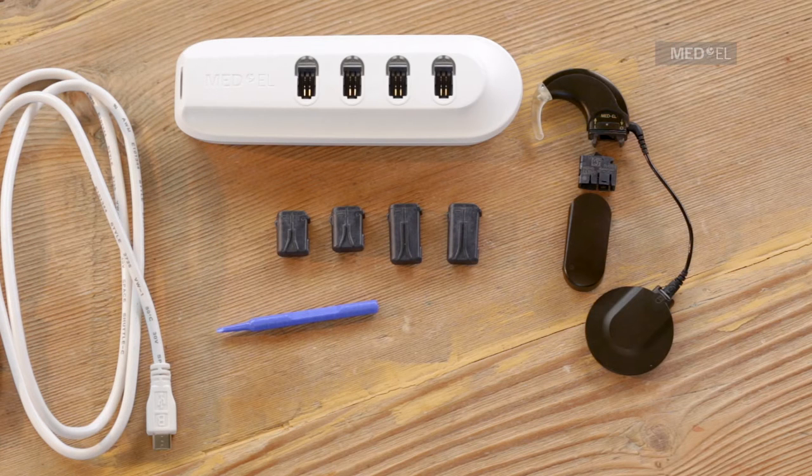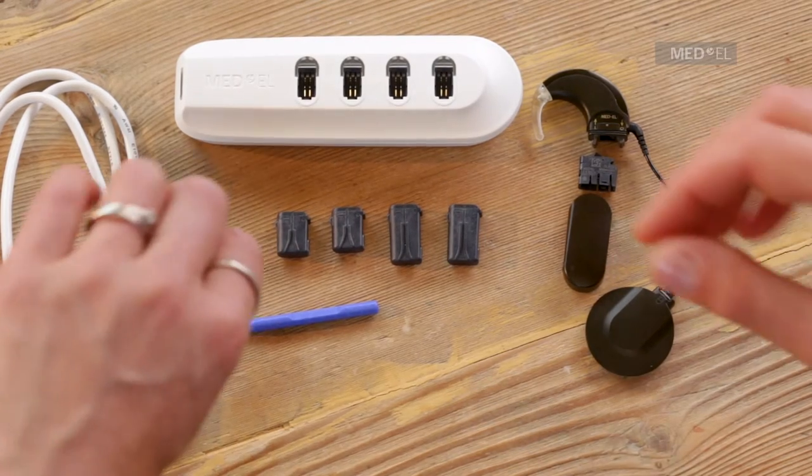There are two types of Sonnet rechargeable battery: the standard battery and the smaller micro battery. Both types are attached to the audio processor in the same way.